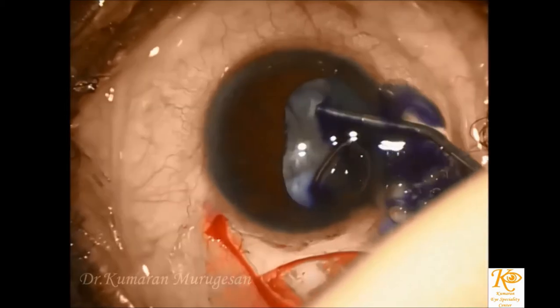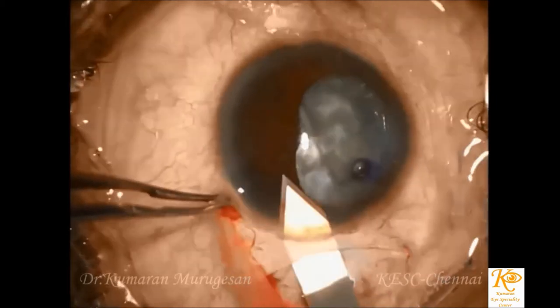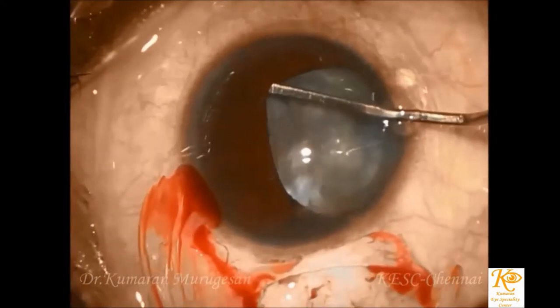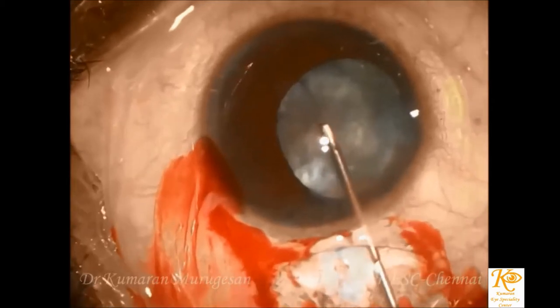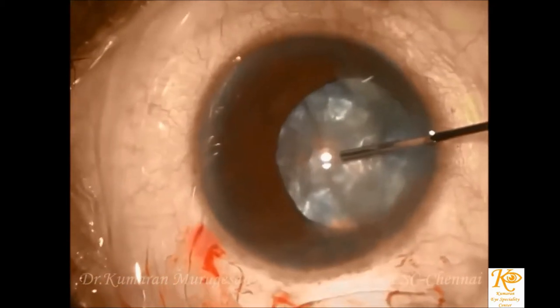A complete and adequate sized capsulorhexis is performed under trypan blue staining and following the triple soft shell technique, where a dispersive viscoelastic device coats and protects the endothelium, followed by a cohesive viscoelastic in the center to maintain space, and a lake of balanced salt solution overlying the nucleus in which the capsulorhexis can be performed with ease.